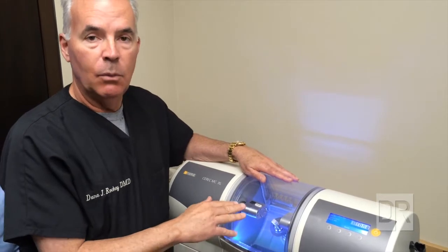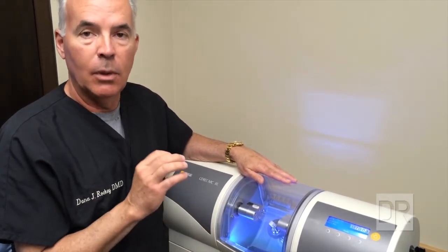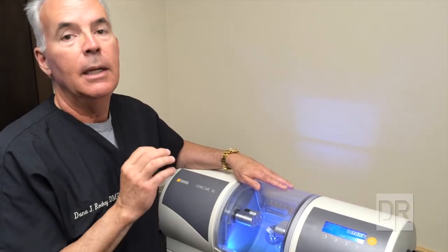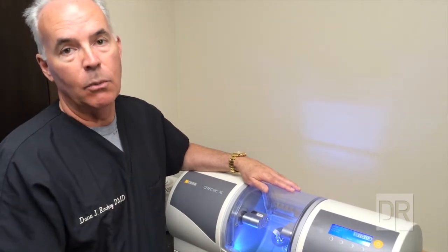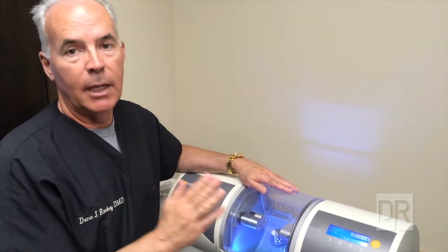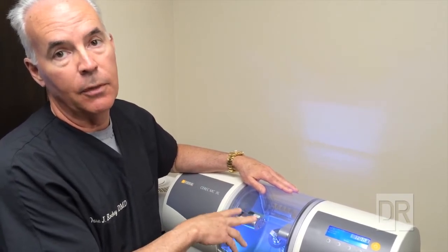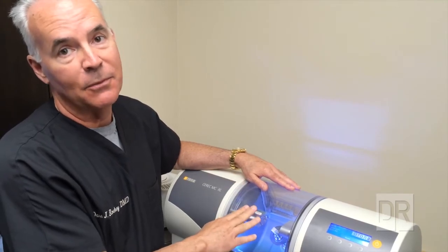We take it out of the mill, trim and polish it a little bit, chemically treat it, and drop it into the hole in the patient's tooth. It's a great advancement — we can numb the patient only once, drill the tooth only once, and make the permanent porcelain solution, put it into the tooth, and the patient is finished all in one day, all in one visit. It's a great advancement. Thank you.